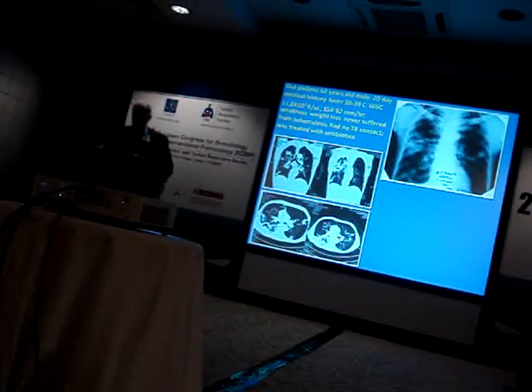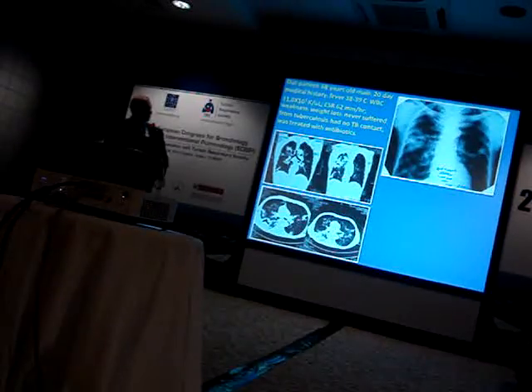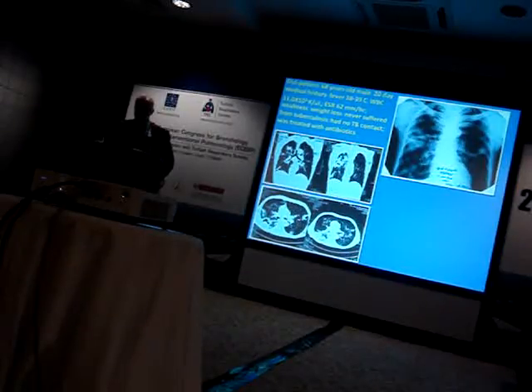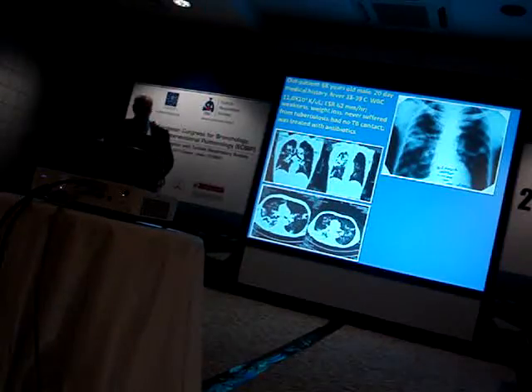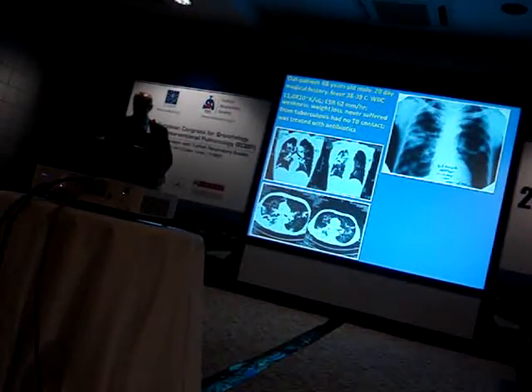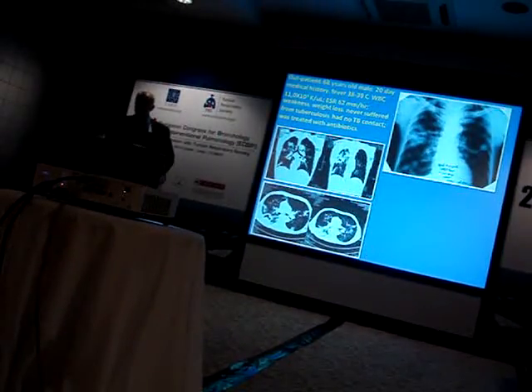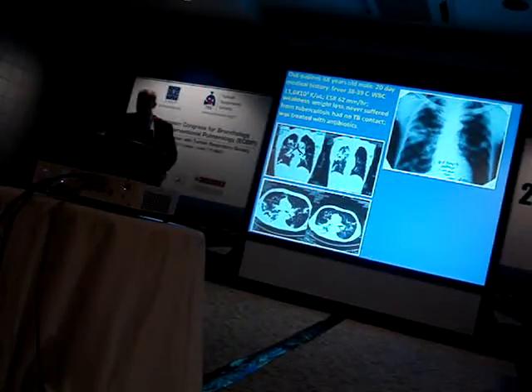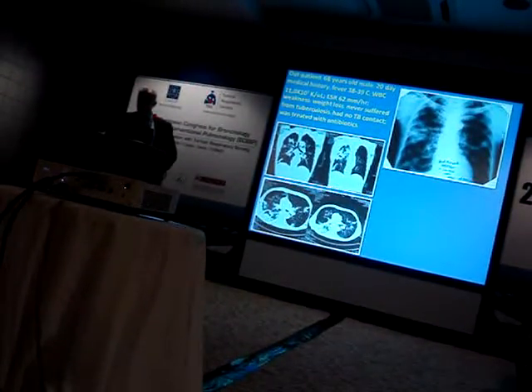For us, as practitioners, this method was most valuable in complex cases, and I would like to show you some of them. First one, a 68-year-old male with a medical history of 20 days. He complains of fever, weakness, weight loss. His condition was severe despite the long-term antibiotic therapy. His initial diagnosis was abscess. And we performed bronchoscopy and the GenoType MTBDRplus assay detected the MTB complex in BAL.